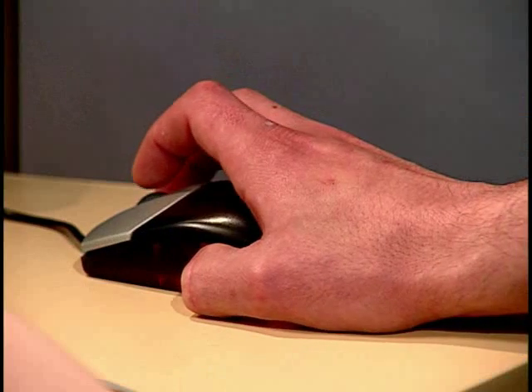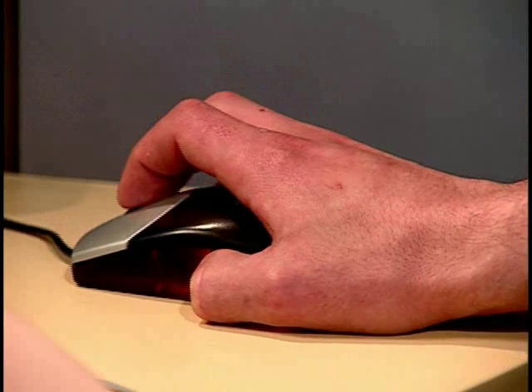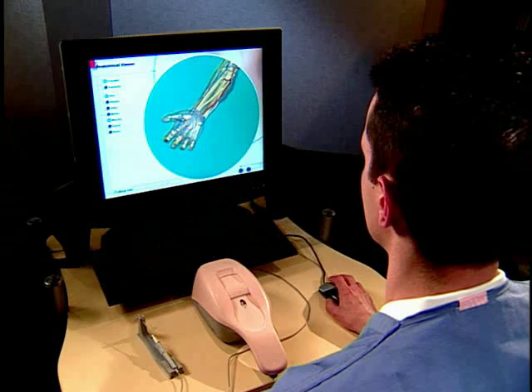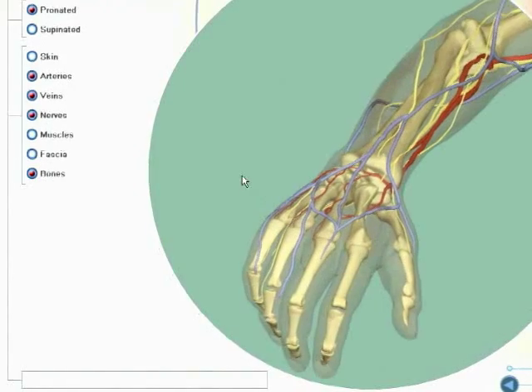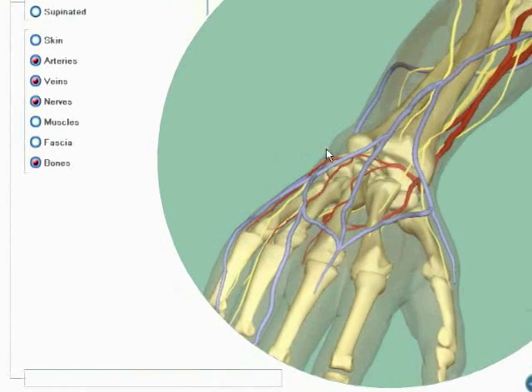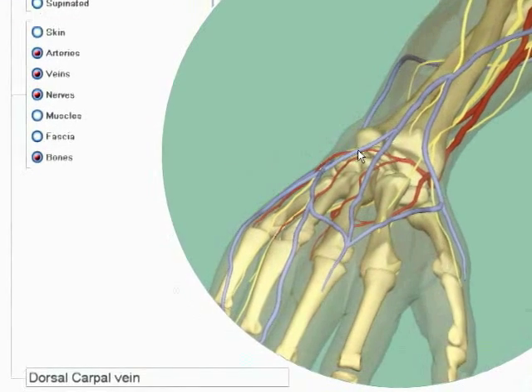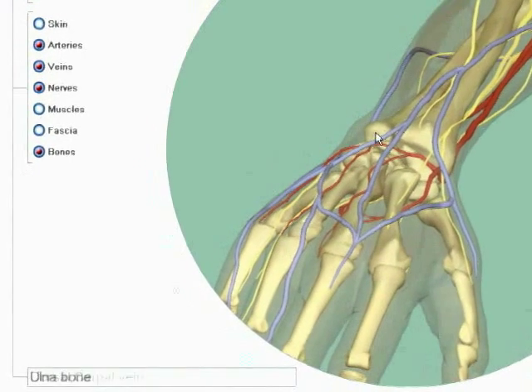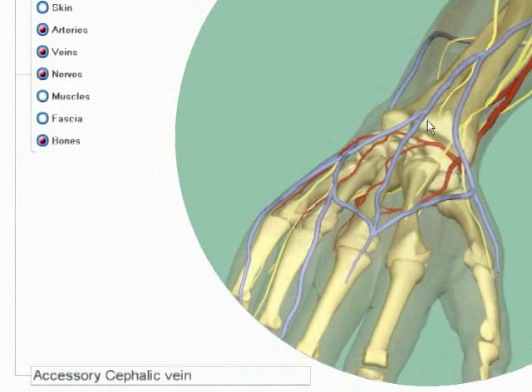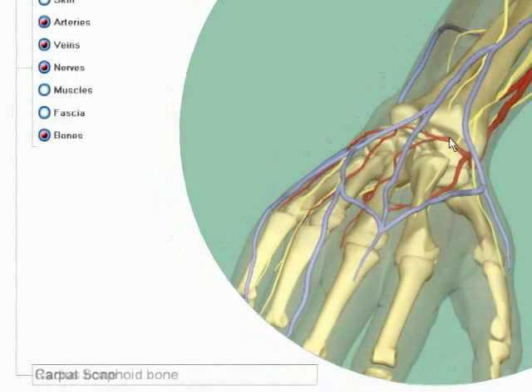If you wish to orient the arm differently, click and hold the middle mouse button and then move the mouse. As you move your mouse over an anatomical structure, its name will appear in a box in the lower left corner, enabling quick identification.